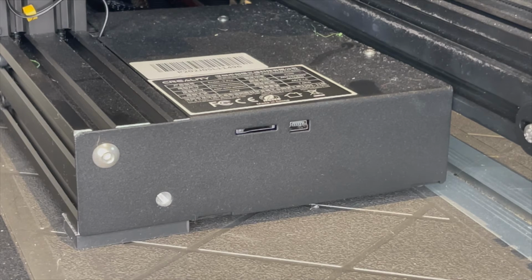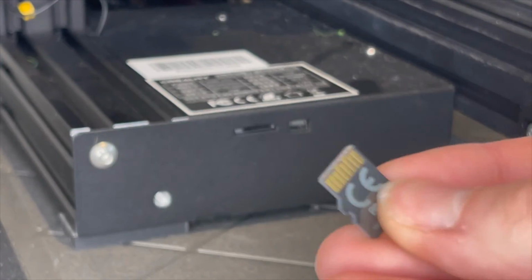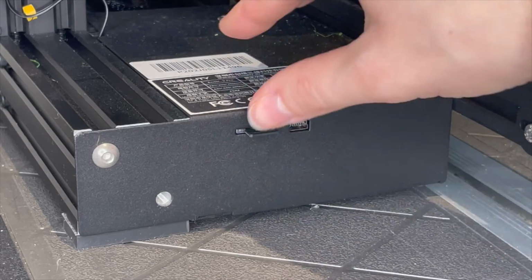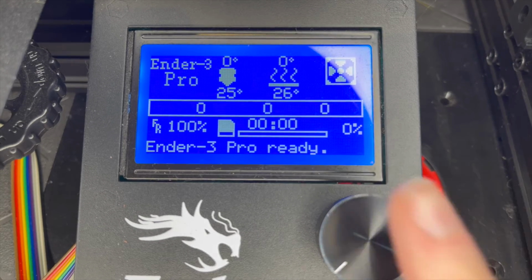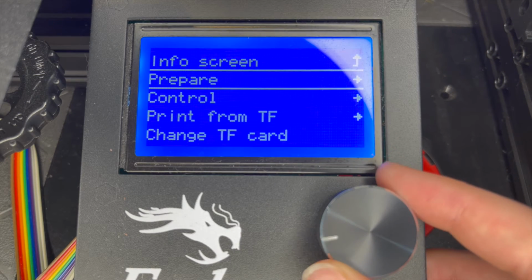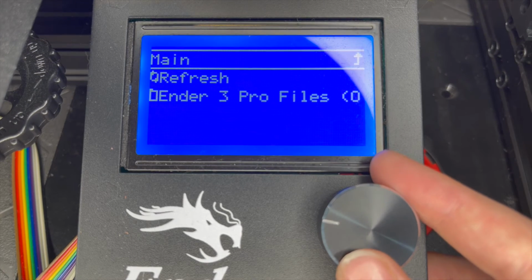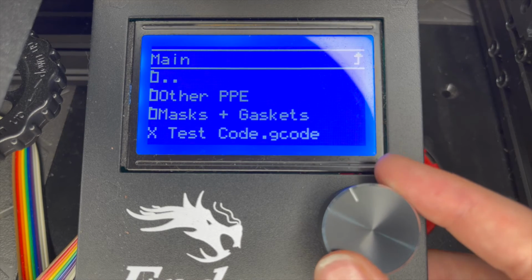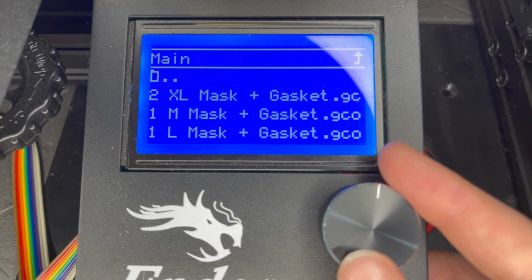To print your mask, take out the SD card from the computer and insert it into your printer. Power up your printer and make sure your bed is level before continuing. Click on the menu, then scroll down to Print from TF. Click on the file that you want to print, and then the bed and nozzle will heat up and your printer will start printing.